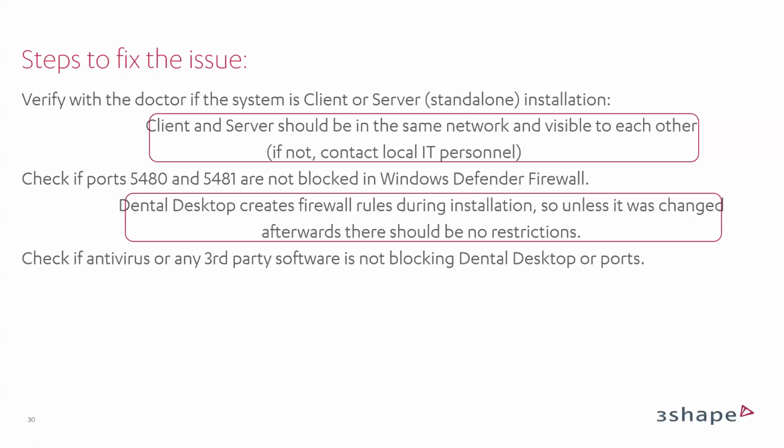We use only Windows Defender Firewall with our Unite application. If you spot that the customer has any kind of third-party antivirus installed in the system, we usually ask them to remove it.